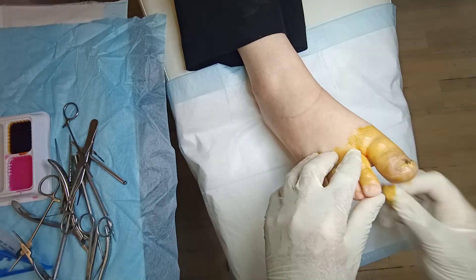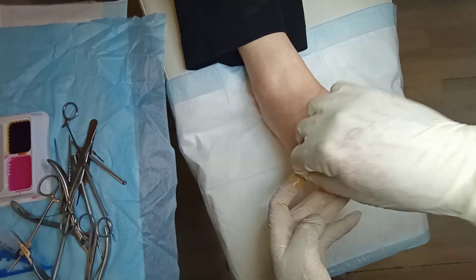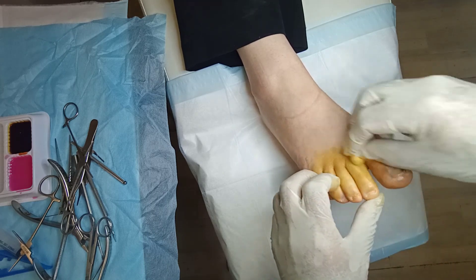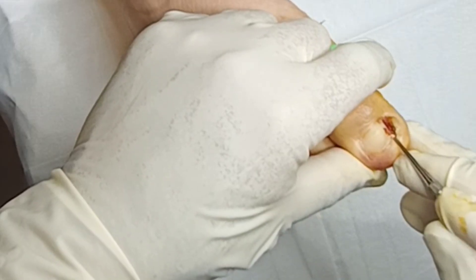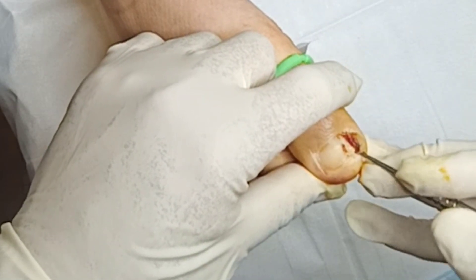Now we're swabbing the toe, making sure we've covered not just the big toe but the other toes as well, because your sterile gloves will touch the other toes when holding certain instruments. So everything is scrubbed. I do give the local anesthetic injection after this, but I don't show that in the video — hopefully I'll show that in another video. Applying the tourniquet — now I've got my sterile gloves on.